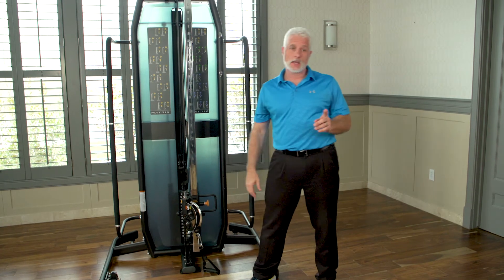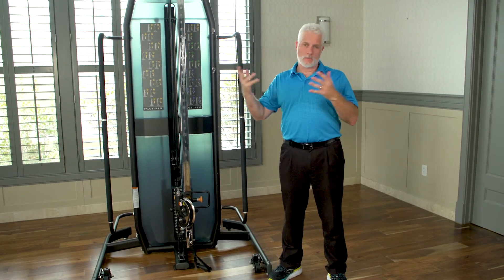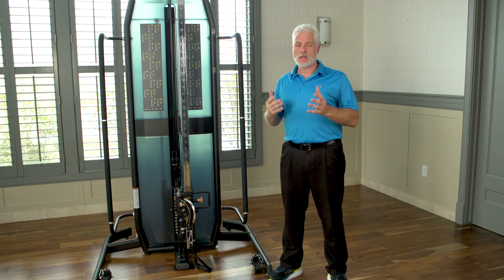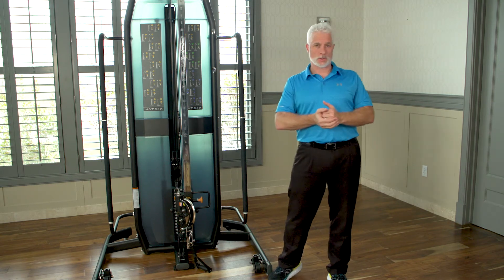My point is, if you want one machine to put in your clinic that gives you variety, is strong, and offers versatility, you can get creative with this machine. You can add bands, you can do a whole bunch of different exercises. If you do that, you're going to not only build up patients but rehab them in a better way — you can be more efficient and more functional.